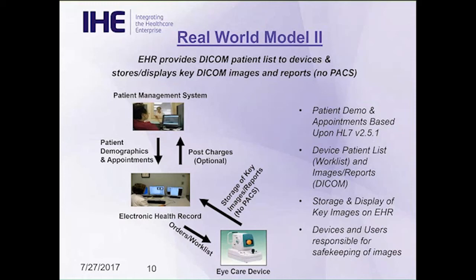So the beginning starts out the same. There's no difference between how a patient management system, a PMS, connects to an EMR. They do the same HL7 messages to manage the appointments and the patient. And again, they can do billing. Also, the beginning to the IHE device is the same.